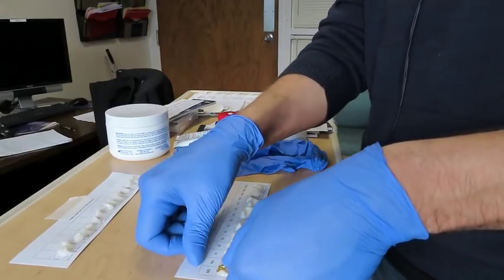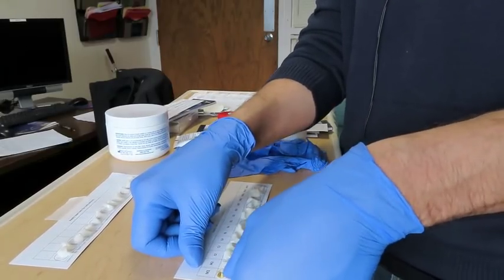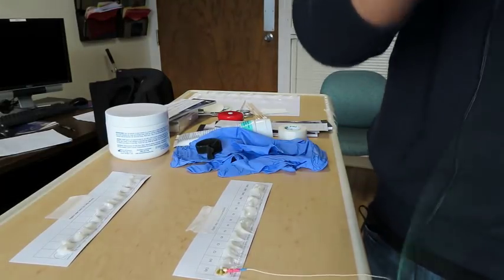So I'll start off with this one here. Okay, take the paste, press it on. There you go. That's wire number 1. Okay, you're going to grab your other wire.